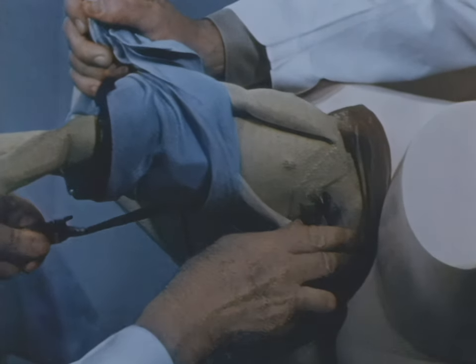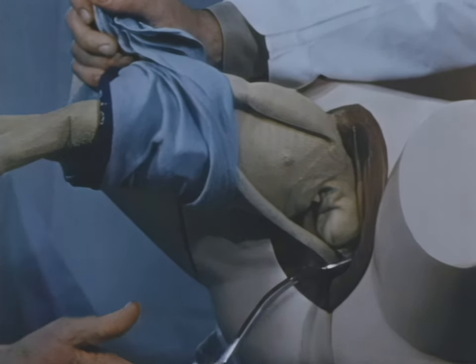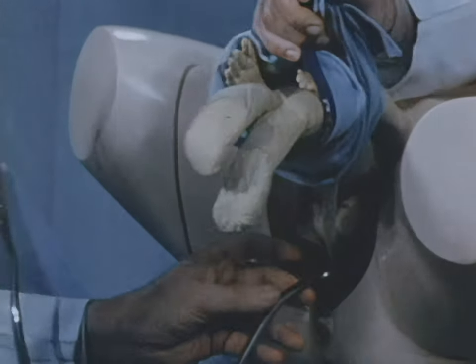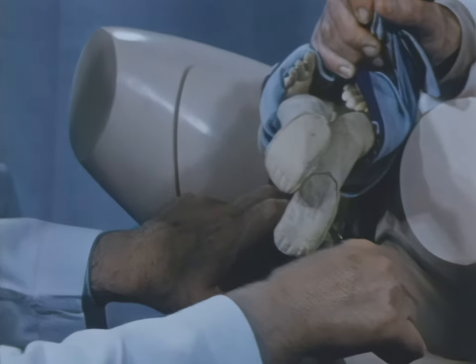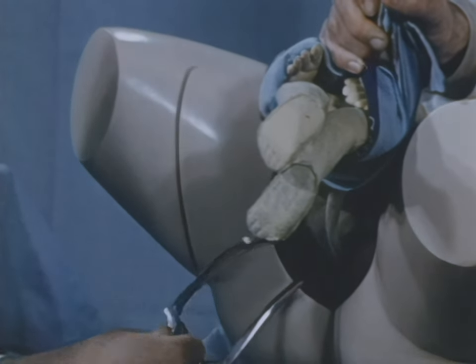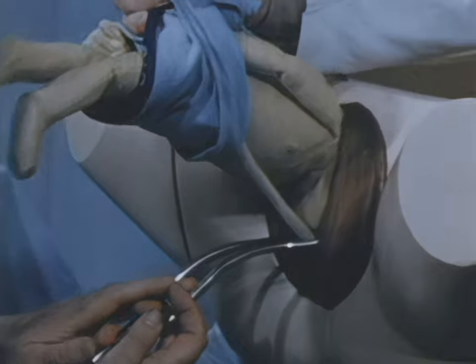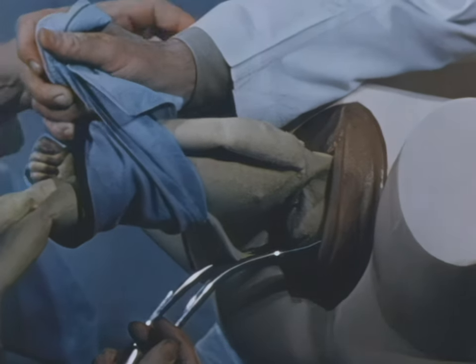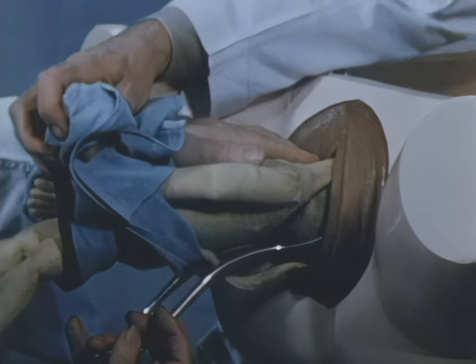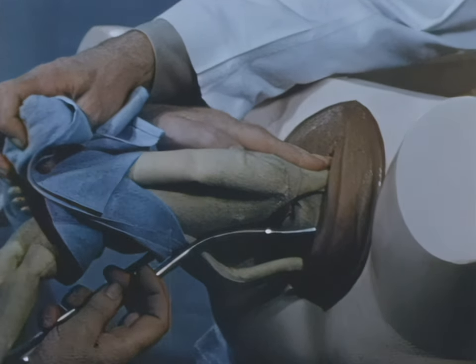Left blade to the left side, to the right ear. The body is carried to the opposite side. Right blade, right hand, right side, left ear. Then the body is lowered to the level of the shanks, and the left hand of the operator splints the neck.